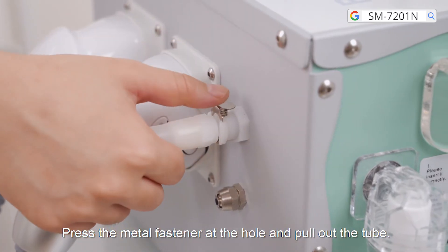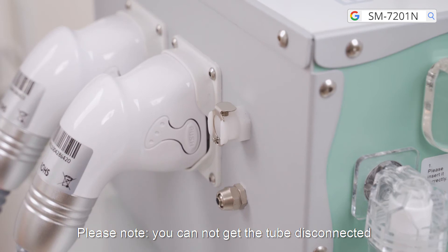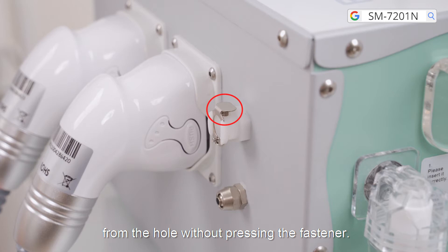Press the metal fastener at the hole and pull out the tube. Please note: you cannot disconnect the tube from the hole without pressing the fastener.